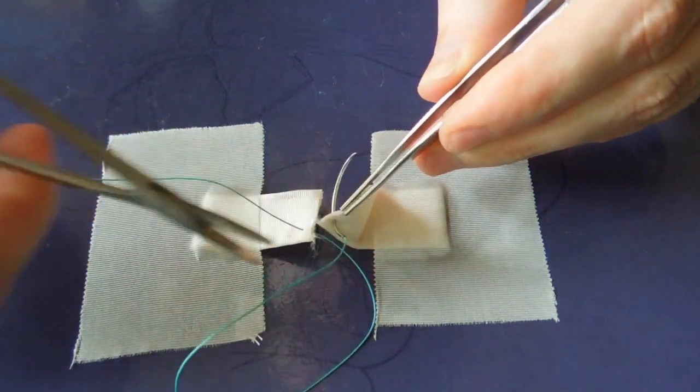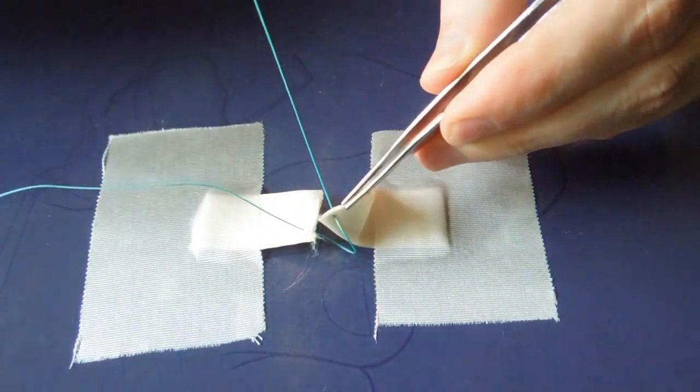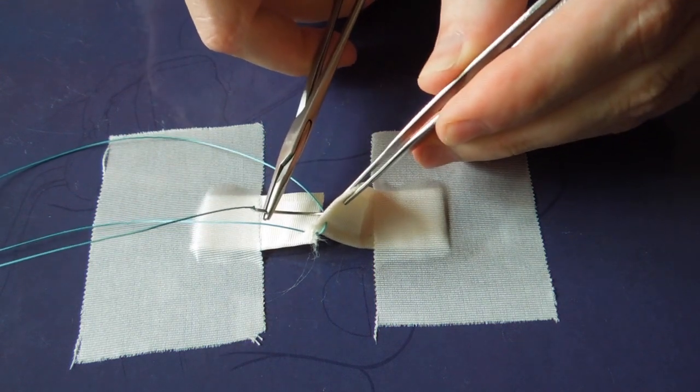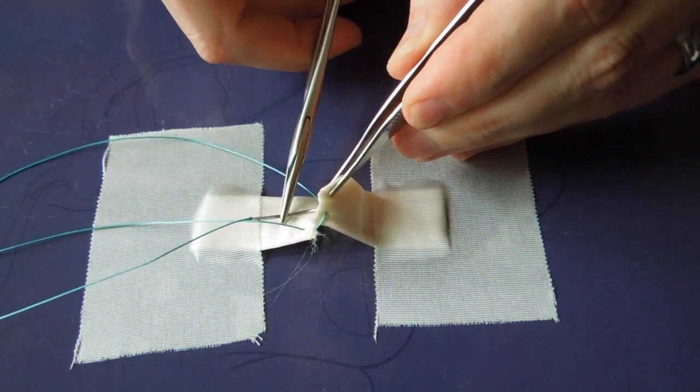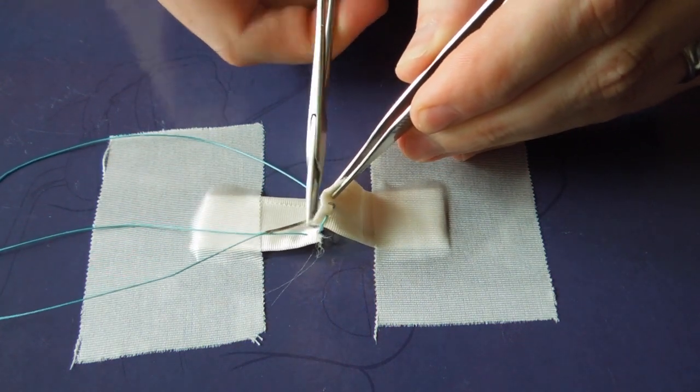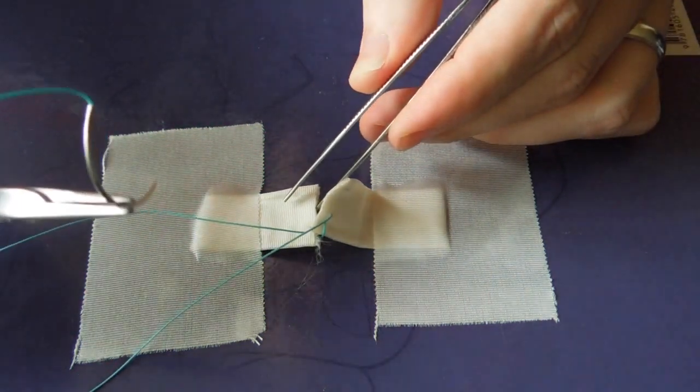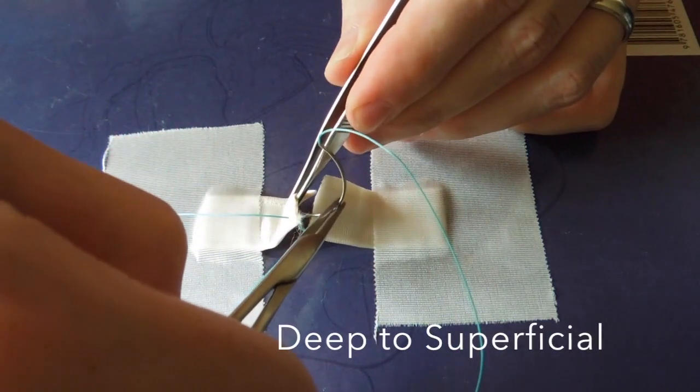Now we're going to remain on side B and again change our orientation here, and this time we're going to throw deep to superficial. We're going to perform the same throw on side A now, deep to superficial.